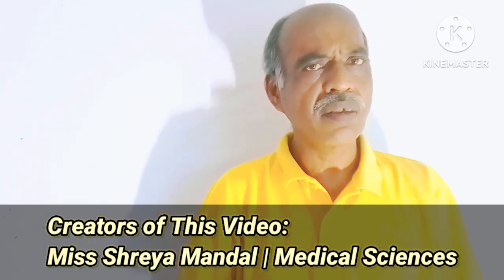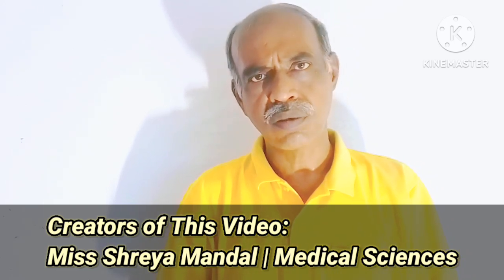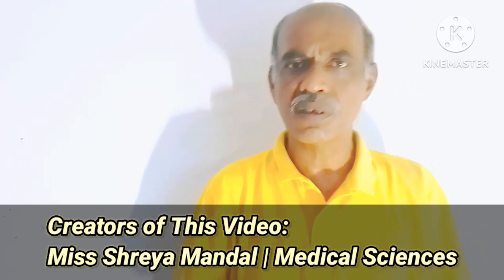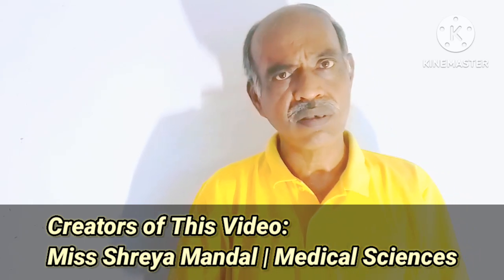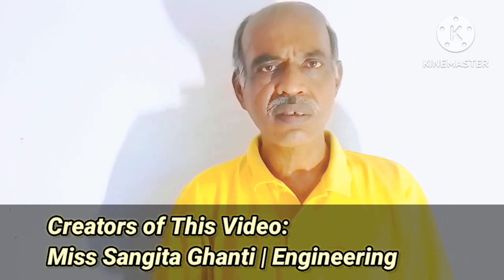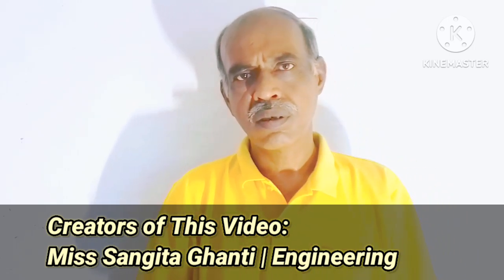So 4D MRI technology. Before that, you should know 3D MRI technology. MRI means magnetic resonance imaging. And in the case of traditional MRI techniques, what is done? Images are taken, but those images are static images. They can show you only the structures.